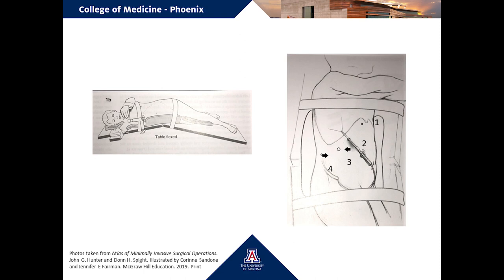The patient is positioned in left lateral decubitus with the bed flexed in line with the superior aspect of the anterior superior iliac spine. Trocar placement for a robotic right adrenalectomy on the DaVinci XI is similar to laparoscopic trocar placement. The lateral-most trocar is positioned more medially, placing all four trocars in a linear fashion about six centimeters apart and a few finger-breadths off the costal margin. The camera is inserted in trocar 3, trocars 2 and 4 serve as the main working ports, and the instrument in trocar 1 is used for liver retraction. The robot is docked perpendicular to the bed over the patient's right side.